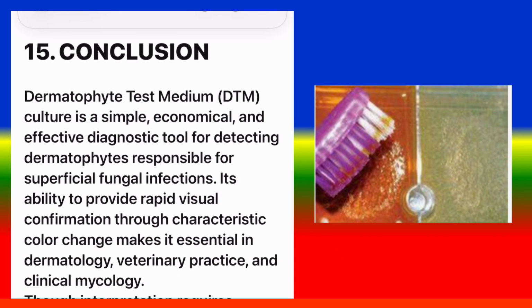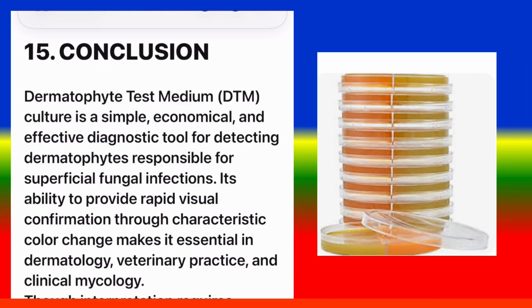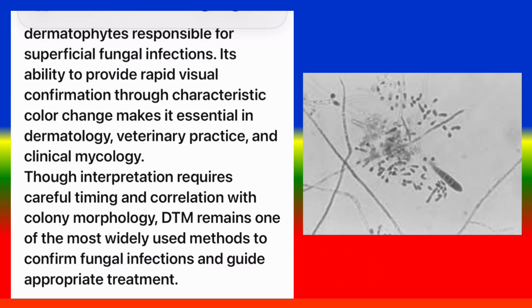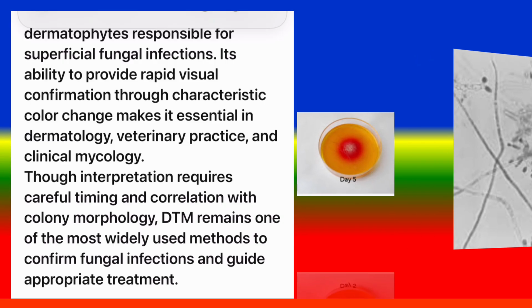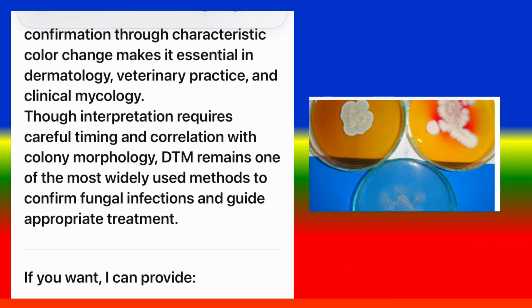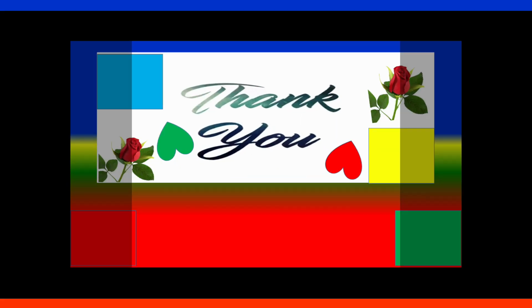Number 15. Conclusion. Dermatophyte test medium, DTM, is a simple, economical, and effective diagnostic tool for detecting dermatophytes responsible for superficial fungal infections. Its ability to provide rapid visual confirmation through characteristic color change makes it essential in dermatology, veterinary practice, and clinical mycology. Though interpretation requires careful timing and correlation with colony morphology, DTM remains one of the most widely used methods to confirm fungal infections and guide appropriate treatment.